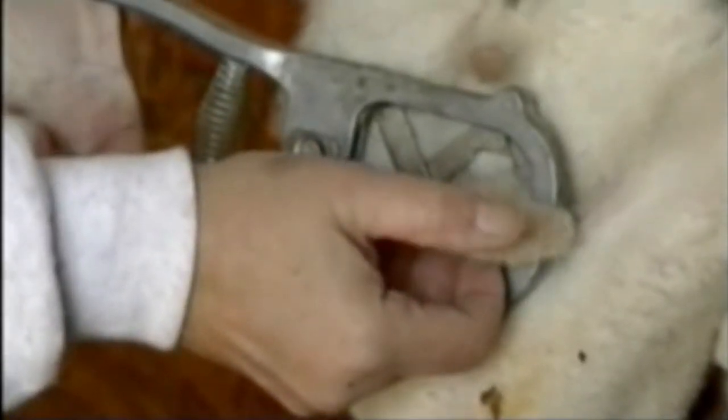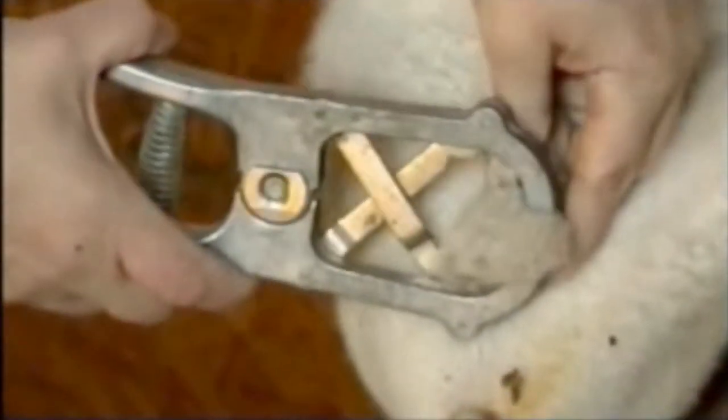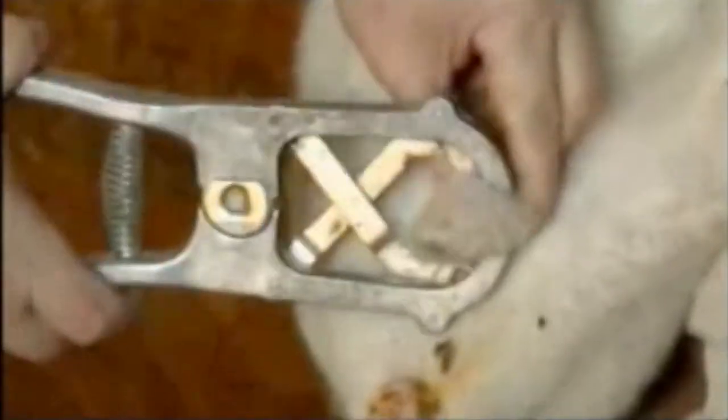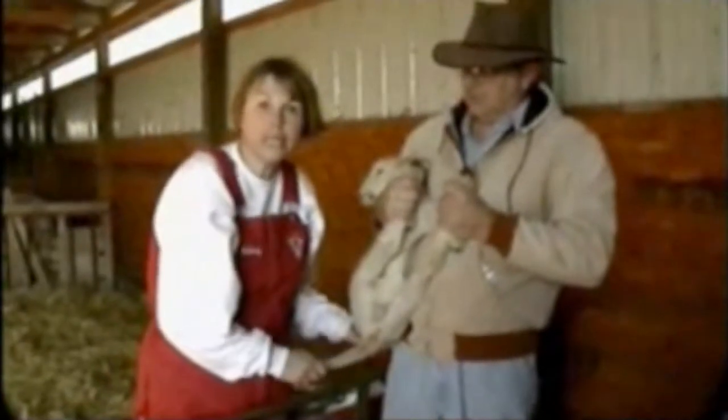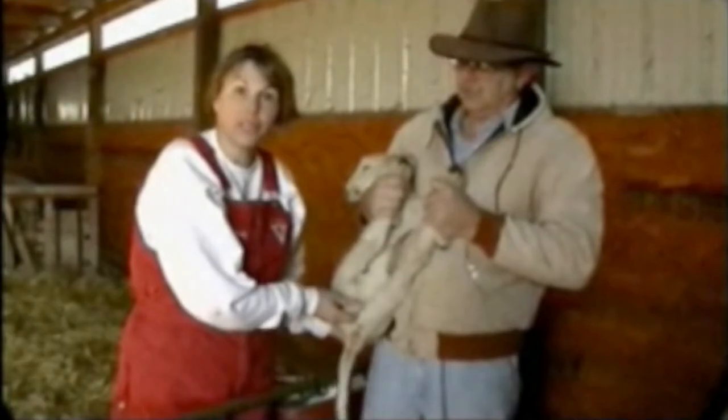Both of them are in there — I felt them. And now I'm going to close the band down. With this hand, I'm pulling the band towards the lamb, and with this hand I'm pulling the elastrator device away from the lamb. I want to double check and make sure that both testicles are in there, and they are. It will take about a week or a little over a week before the tail will fall off and the scrotum will fall off.